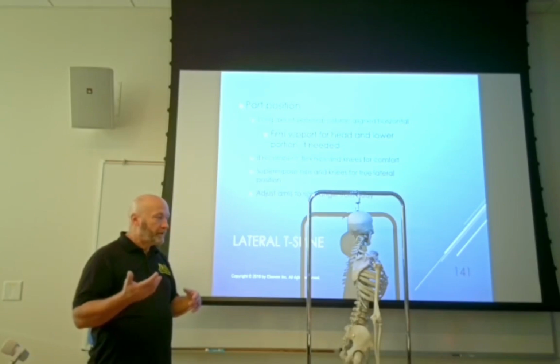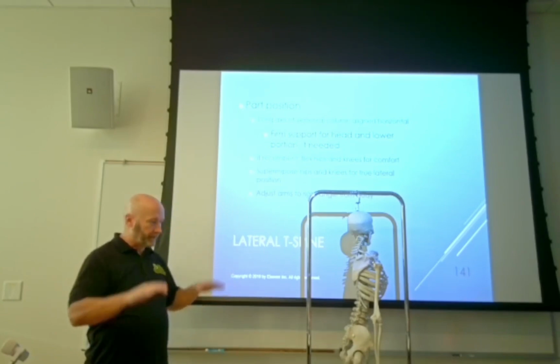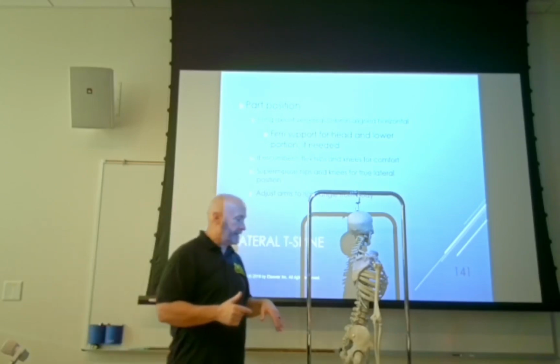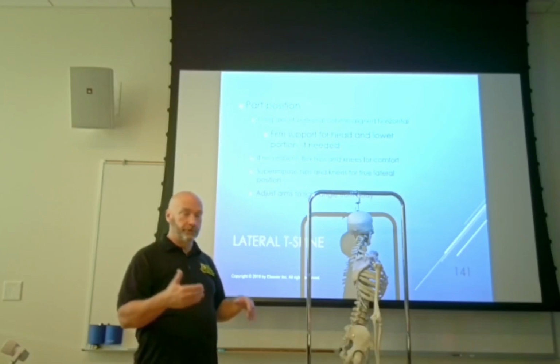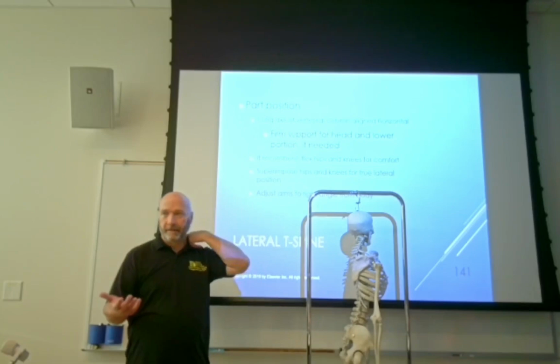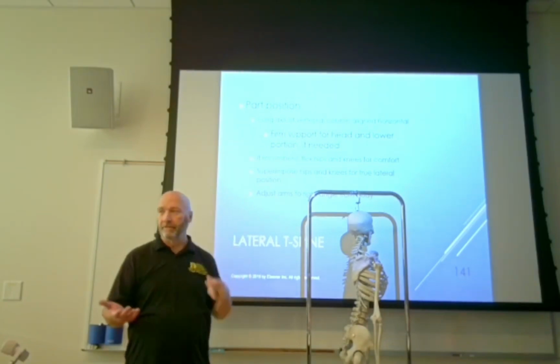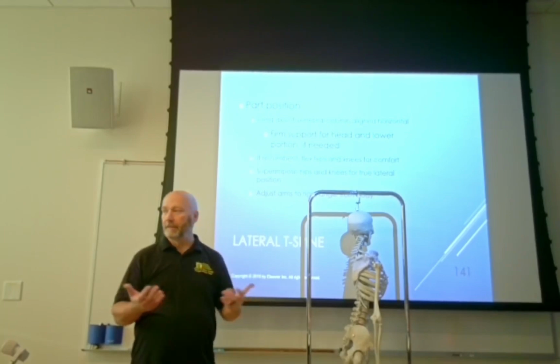So if you don't build the patient's spine up to be parallel with the table and therefore the IR, then what you need to do is angle the central ray until it's perpendicular to the spine. Okay, so the book says that's going to be 15 degrees in men, 10 degrees in women, but it's really going to be according to the patient's anatomy, right?